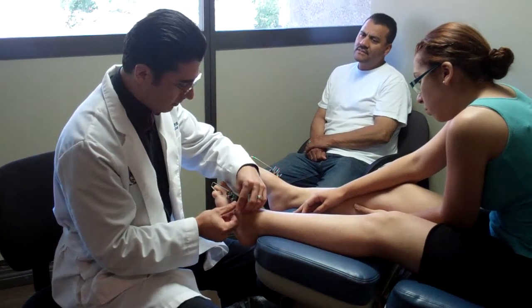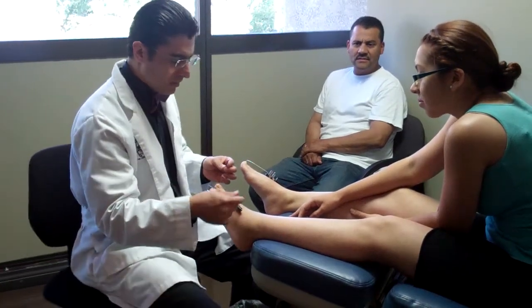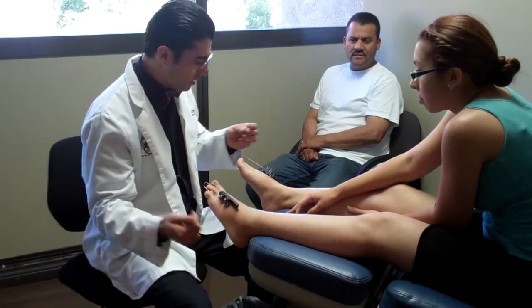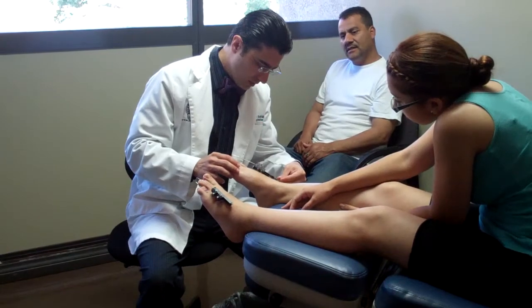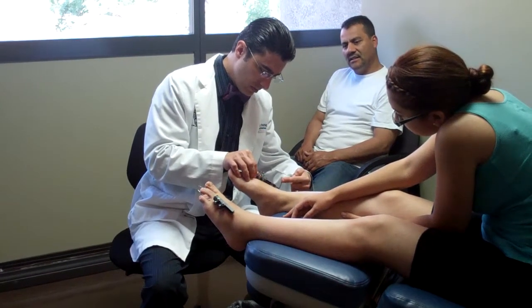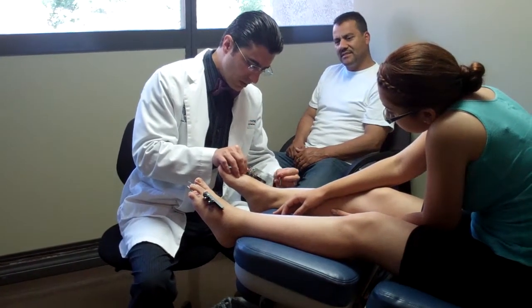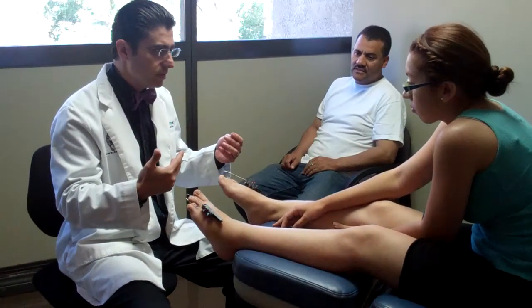And that's it. You do two of these turns every day, so basically it's like a half turn. So you do the same thing on this one — you put the vent right here and you go from this side. This one's a little loose so you might have to do a couple of turns before it starts becoming tighter and tighter.